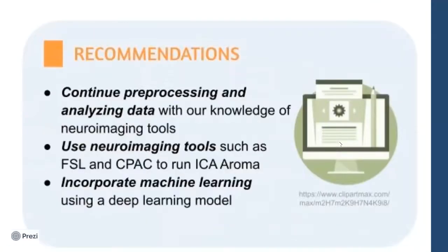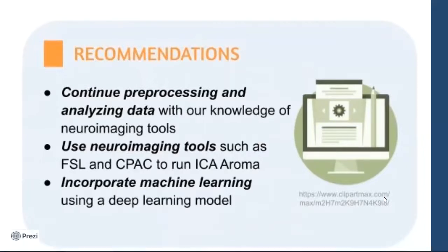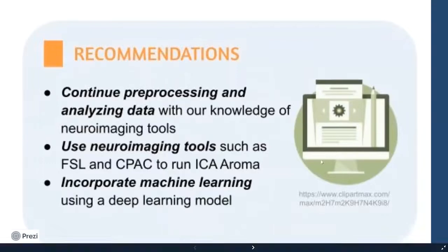So firstly, the remaining data will be preprocessed using fMRIPrep and ICA-AROMA. We then plan on implementing machine learning, and the first step is the time series extraction. The time series extraction feature is a preliminary step for machine learning on fMRI data that involves finding characteristics in the data that help solve a particular problem. Our next work in the fall will focus on preparing our data for machine learning.